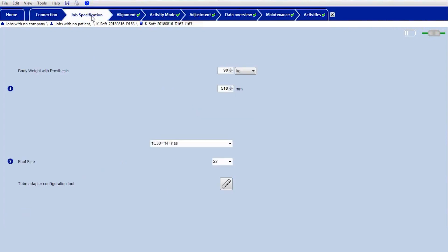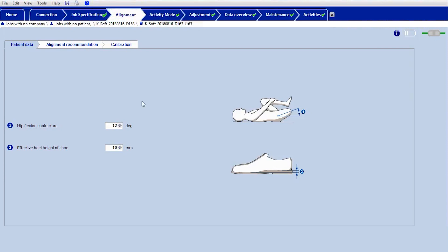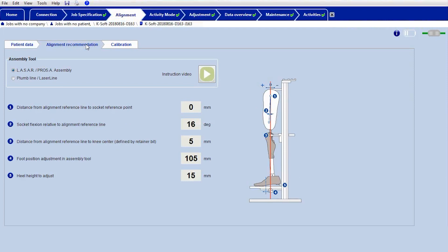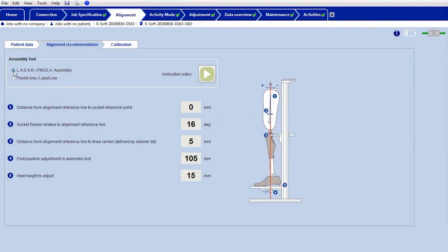Enter the user data in the job specification. Then transfer the values specified in the alignment recommendation to the bench alignment. If you are not using an alignment tool such as PROS-A or LAZAR assembly, please observe the alignment recommendation for plumb line alignment. If you are using an alignment tool, the required specifications such as prosthetic side, heel height and foot rotation should be carried out using the alignment tool.